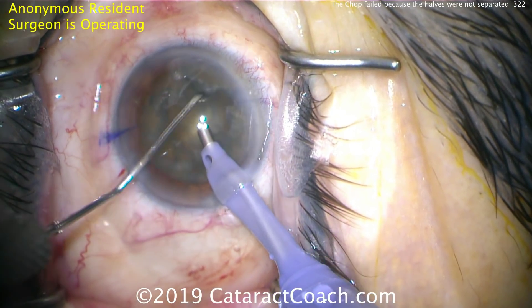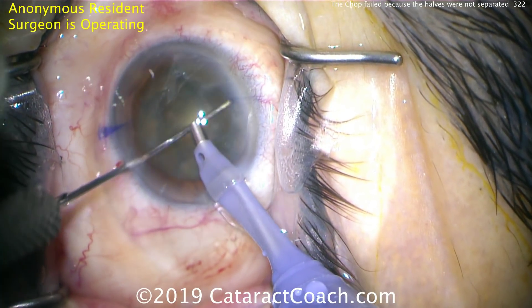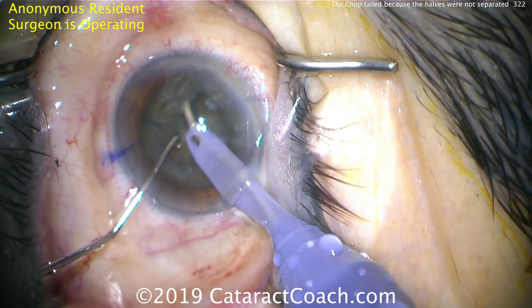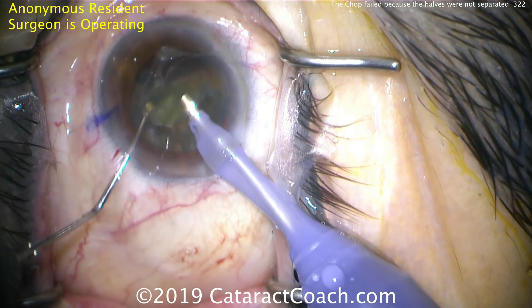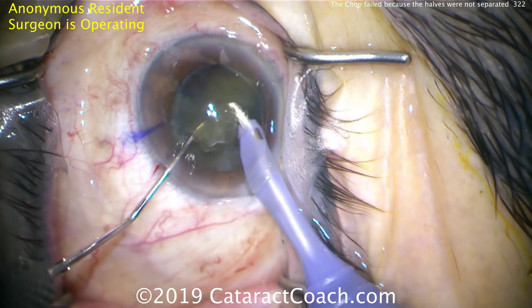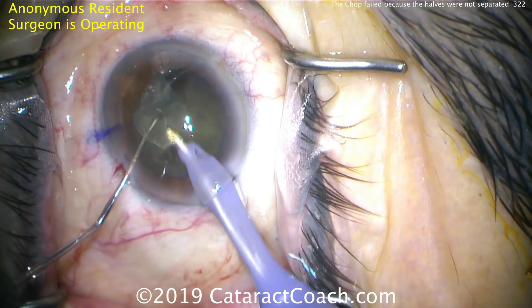Rotating the nucleus to try again — at some point we'll finally be able to bring it out of the bag, because by bowling it out we've debulked the nucleus. Phacoprobe again, trying to get around a piece — and there we go. Finally we can get part of the nucleus up. Even now it's still not separated into two halves. Only at this point do we finally separate the halves.